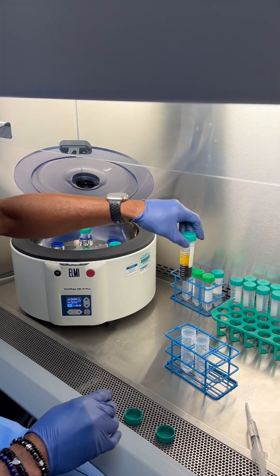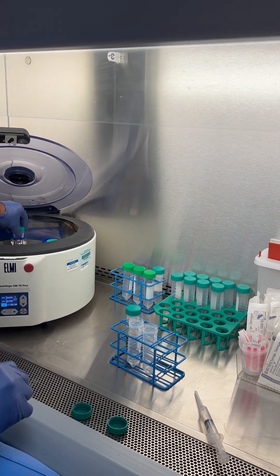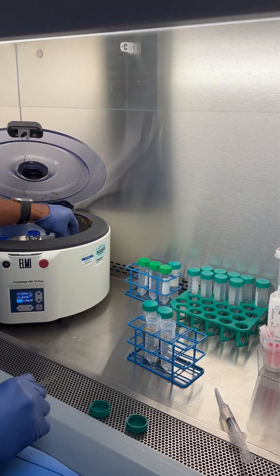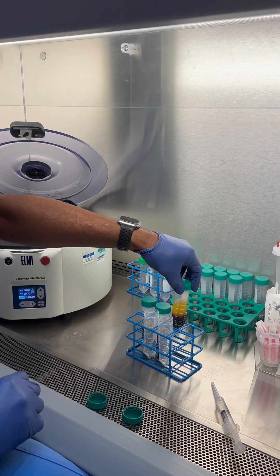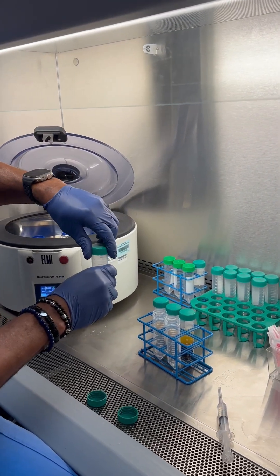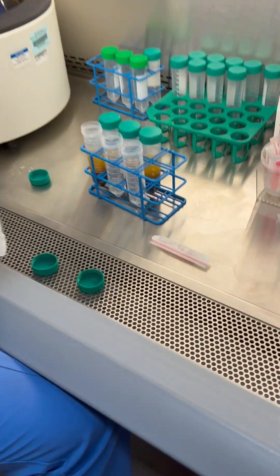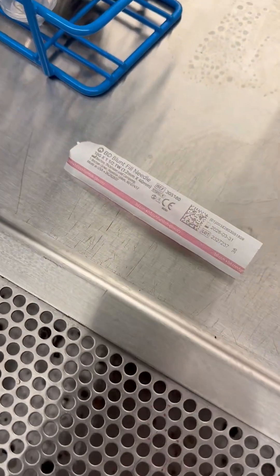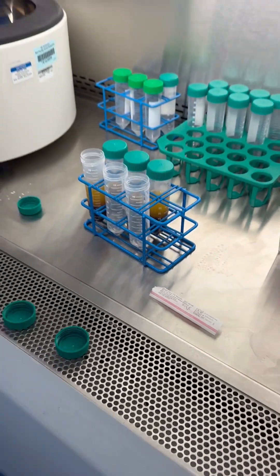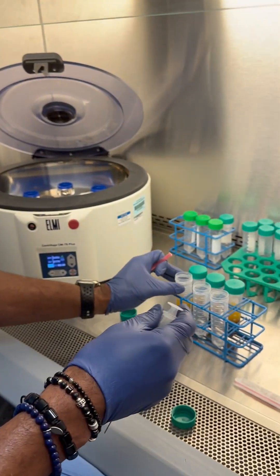This is what the spin looks like after two and a half minutes — obviously we're very careful not to shake it up. We're using blunt needles, which is really important because a beveled needle will mess up your interface. With a blunt needle, we can do this carefully.